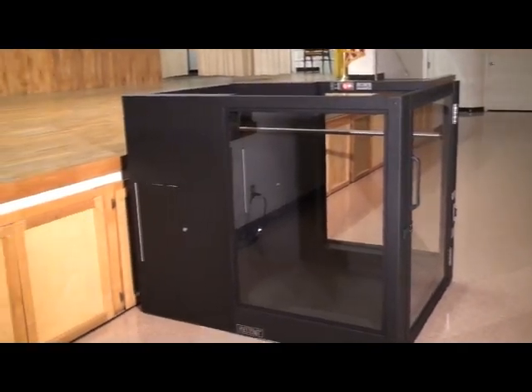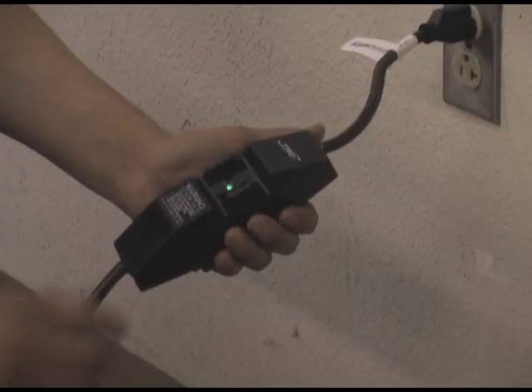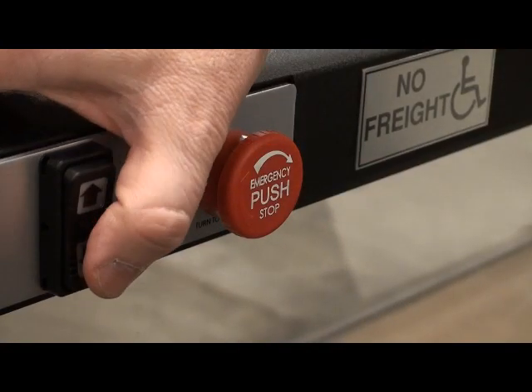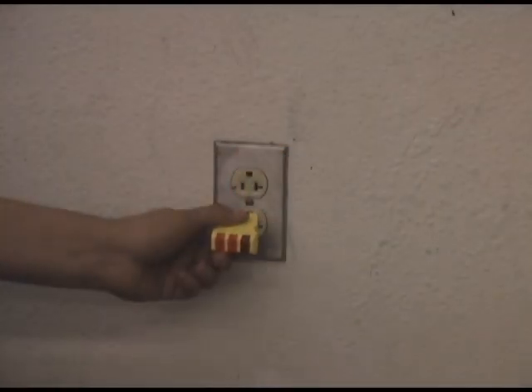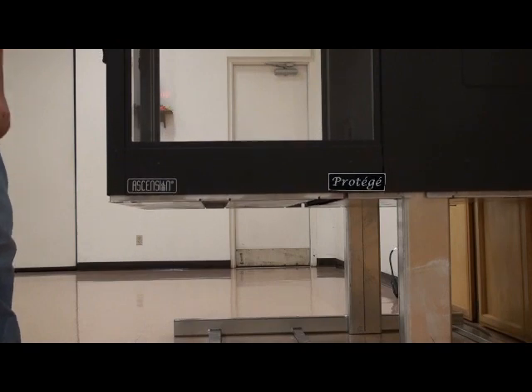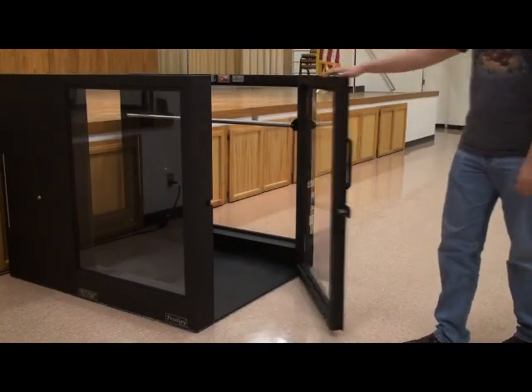Troubleshooting: if the lift does not operate after setup, check the following items. Make sure that the power cord is plugged in. Make sure that the ground fault circuit interrupter on the power cord is reset — push the reset button in if necessary. Make sure that the emergency stop switch is not activated; reset it by rotating the button clockwise if necessary. Make sure that the outlet has power. Check to make sure the lift car's safety underpan is hanging freely and evenly from the underside of the lift car. The lift car will not operate downward if the safety underpan is actuated. Make sure that both gates are closed — the lift will not function with either gate open.